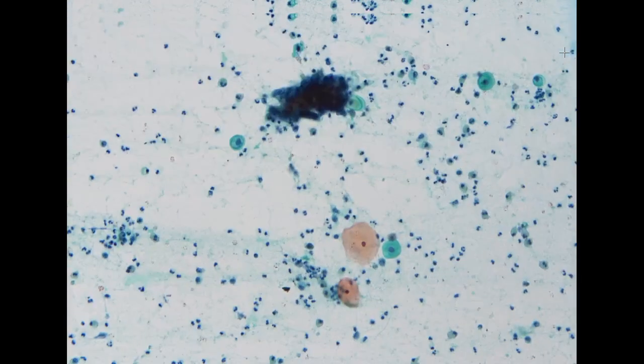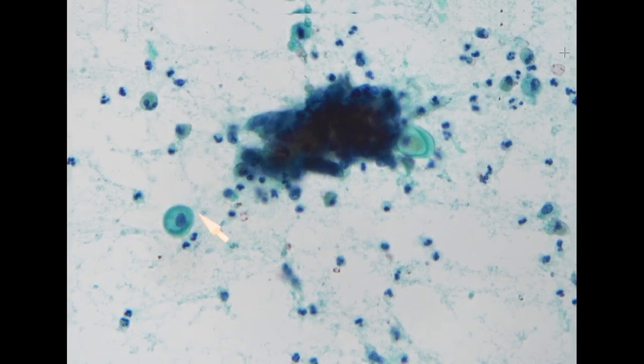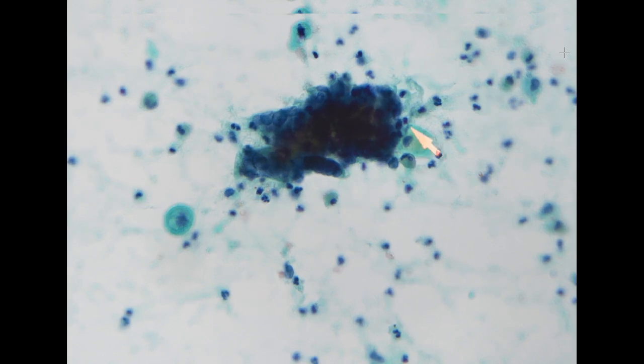So along this specimen, we have some very tight clusters of cells. Additionally, these squamous cells seem to be a little bit abnormal. So I think this qualifies for ASCUS.